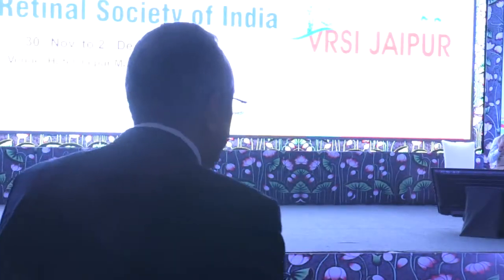Sir, does your technique let you remove all the folds with PFCL alone, or do you have to make extra maneuvers in any of the cases? Again, please, the question? You have put the PFCL after inducing an RD in most of your cases. Were all the cases successful with only PFCL, or do you have to do any extra maneuvers? No, usually PFCL and draining the anterior fluid is quite enough.